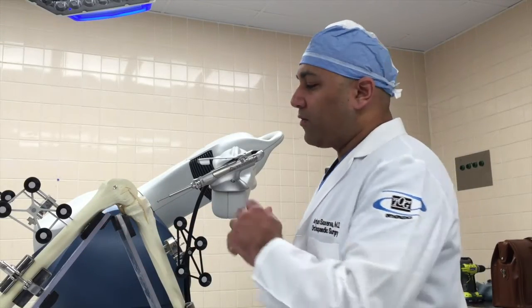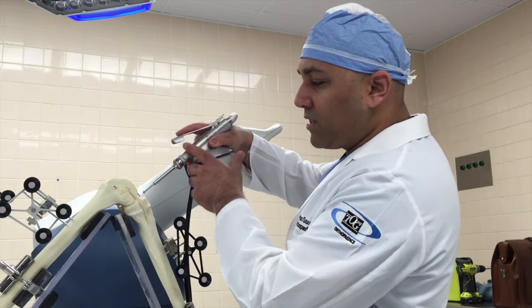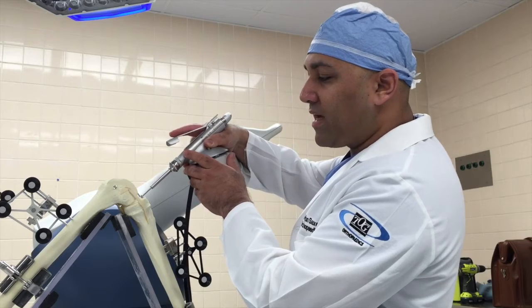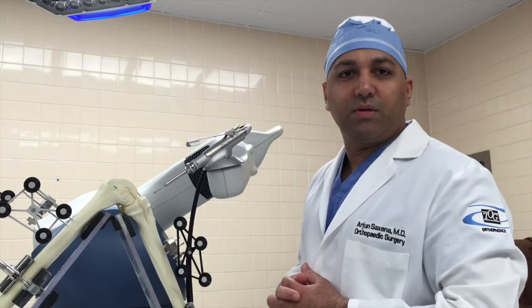Once these trackers are placed, the computer allows the surgeon to use the robotic arm with this small bar to resect bone from the tibia and femur, allowing for the components to be positioned.